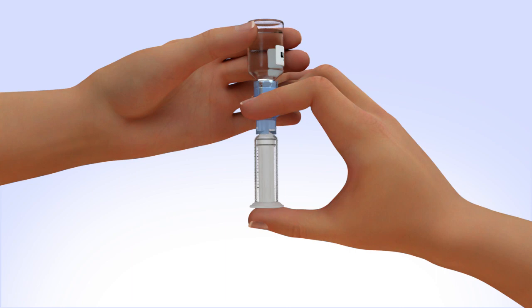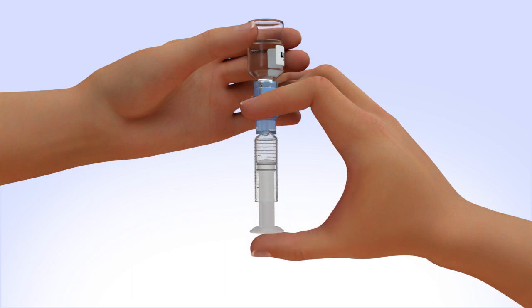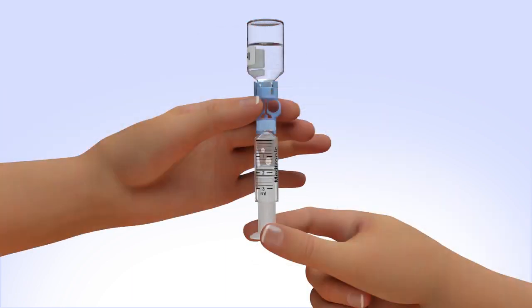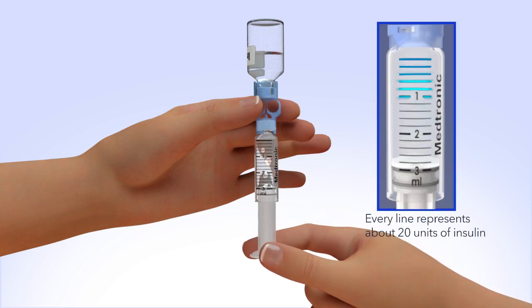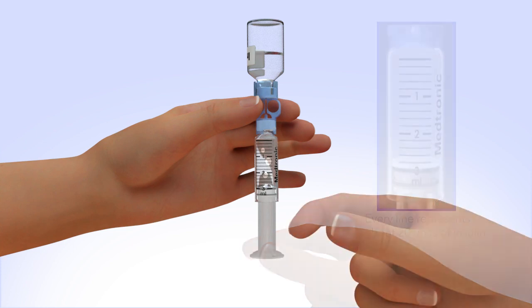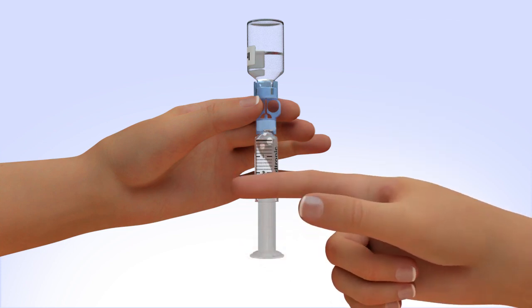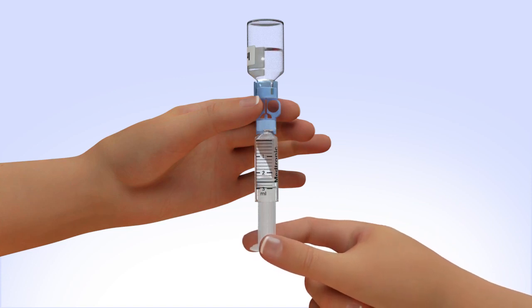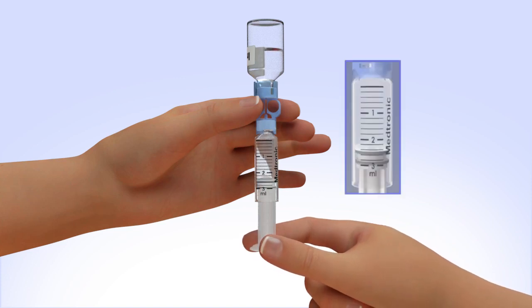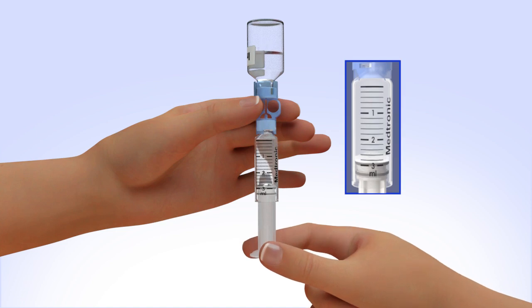Slowly release your thumb pressure from the plunger rod, and the reservoir will start filling with insulin. When the reservoir stops filling, pull down on the plunger until the top black o-ring lines up with the desired amount. Tap the reservoir hard enough to make the air bubbles rise to the top. Slowly push up on the plunger rod to move the air bubbles back into the insulin vial. Pull down on the plunger to fill the reservoir to the number of units desired. Repeat as needed until air bubbles are removed from the reservoir.